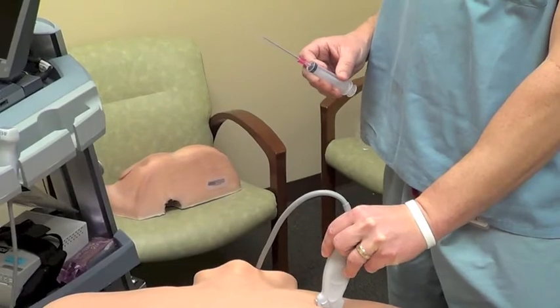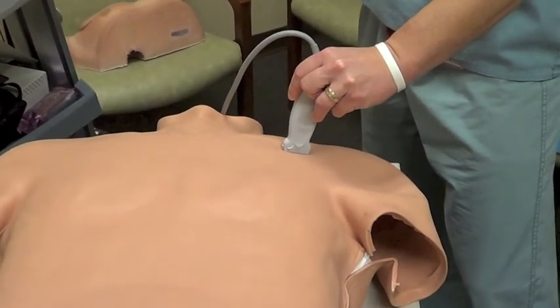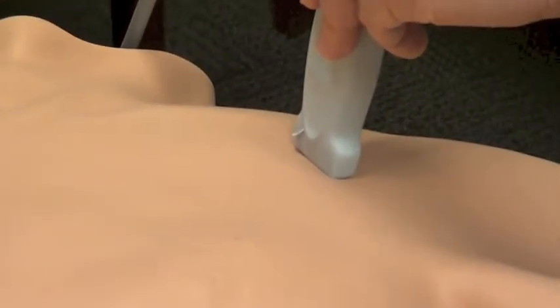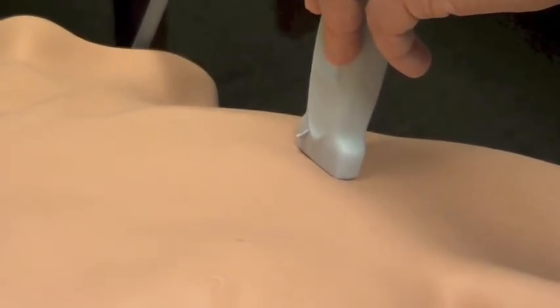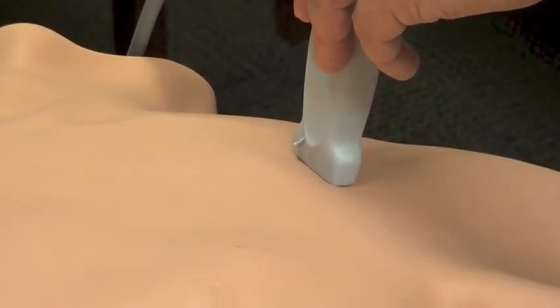Although it can be said that there is better posterior visualization of the tip in long axis view, I feel more comfortable in short axis view as it somewhat mimics the internal jugular vein setup when you are doing a procedure with ultrasound and the internal jugular vein.